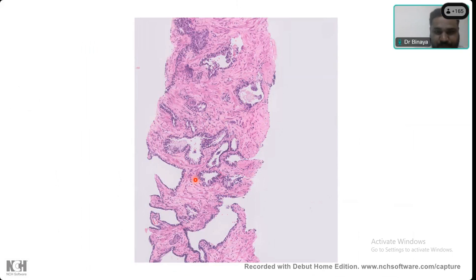Benign, sir. Benign, because again they are large glands. They have a stellate lumen. They have luminal cells and maybe basal cells. But mind you, be very careful. If you are trying very hard to look for luminal and basal cells in every case and every core, you might find it very difficult to identify the basal cells on morphology sometimes. So please don't get fooled by the fact that you are seeing some basal cells. Sometimes basal cells may be subtle. Sometimes the myofibrous cells or the fibroblastic cells may be very closely opposed to the glands, and they may look like basal cells, and you might mistake them for basal cells. So don't go by the fact that these glands are always bilayered.